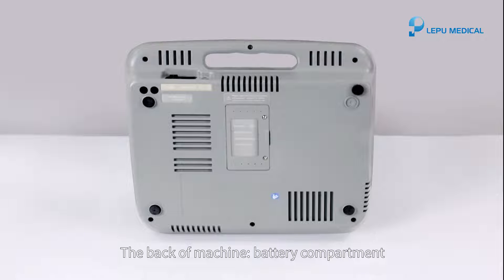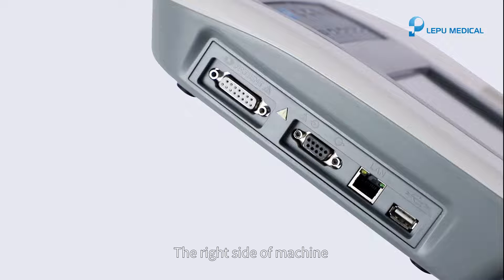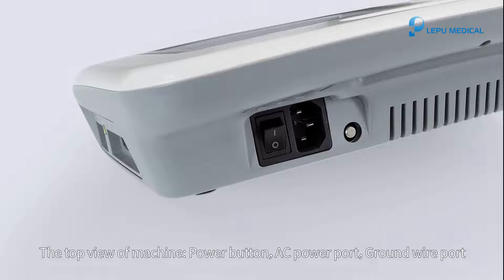The back of the machine: battery compartment. The right side of the machine: patient cable connector, RS-232 port, LAN port, USB port. The top view of the machine: power button, AC power port, ground wire port.